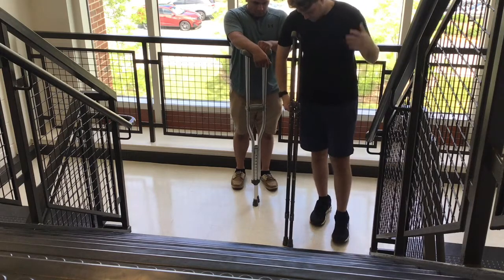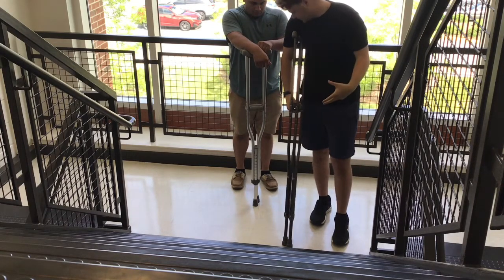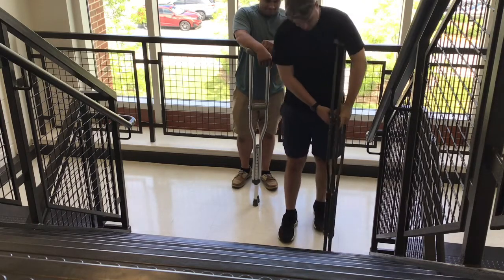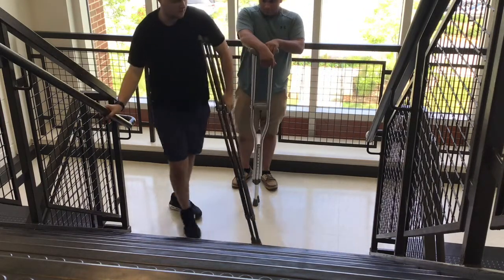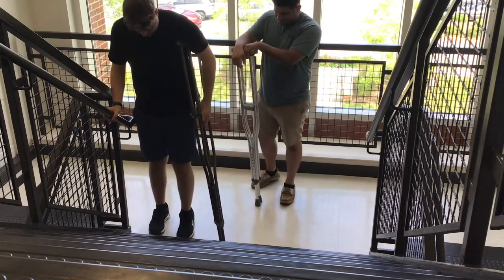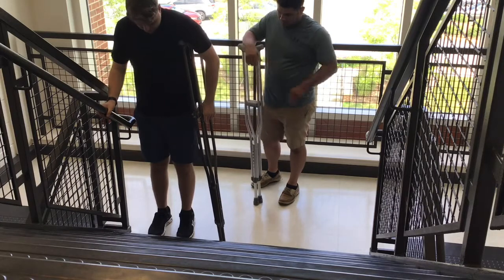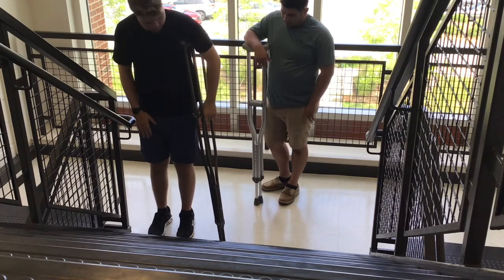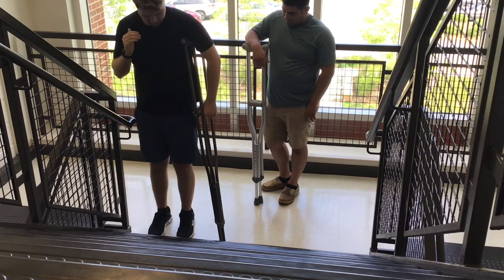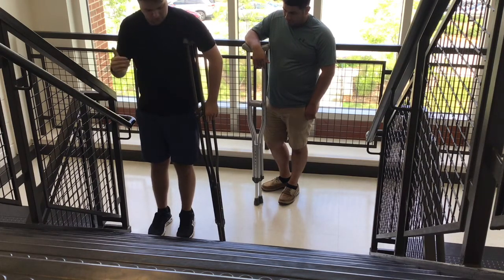For me, we demonstrated my left leg was injured. I'll demonstrate it the way that it would be for you. So you will be on this side, so that way the crutches are on the other side of the rail. And what you will do is you are going to take the foot that is not injured and put it up on the staircase first, and push yourself up on each stair.